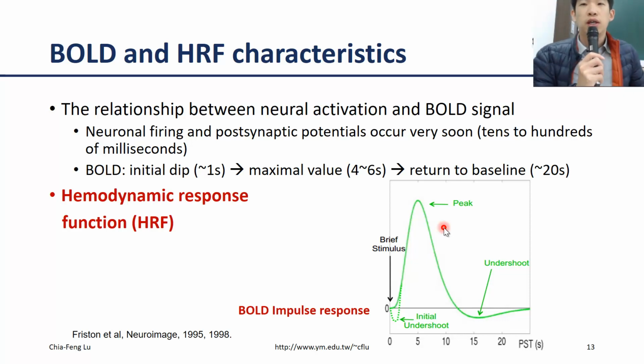Okay. In the second part, I'd like to give you more details about the stimulus timing design. But before that, I have to again mention the BOLD signal properties. And in this slide, I'd like to give you a new term right here. It's called the HRF. It actually represents the hemodynamic response function.